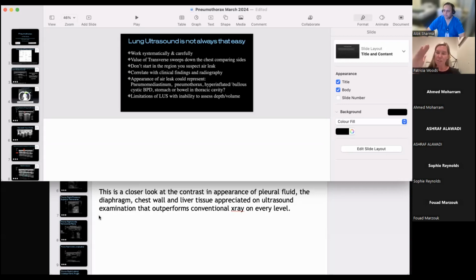kind of pivotal movement. The literature would talk about the strength and definition, lack of attenuation with depth, a sort of geometric shape to it. I think they're stronger when, at first look, you think, oh God, that's quite prominent. Whether there are more and more of them, I'm uncertain, but if there is, you have to think why.